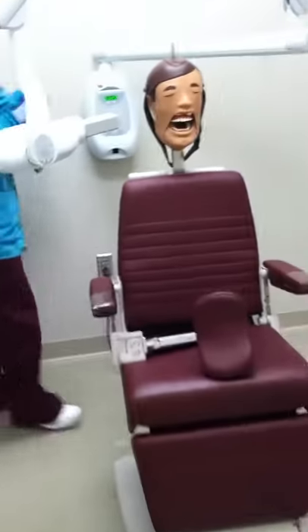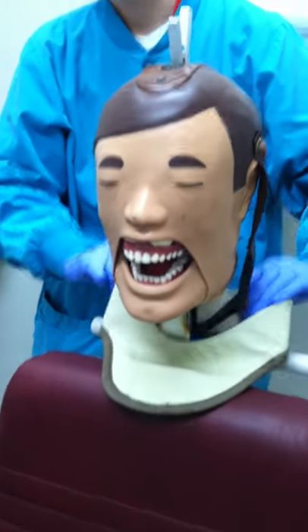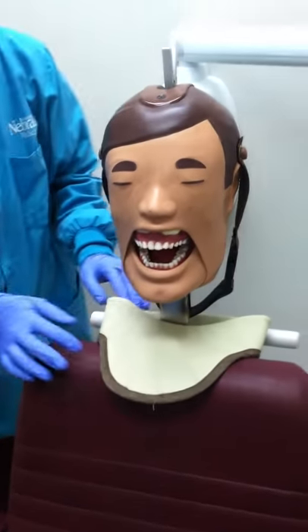Apply the thyroid collar around the patient's neck. Make sure to remove any jewelry, glasses, or other metal items that would interfere with the radiograph.